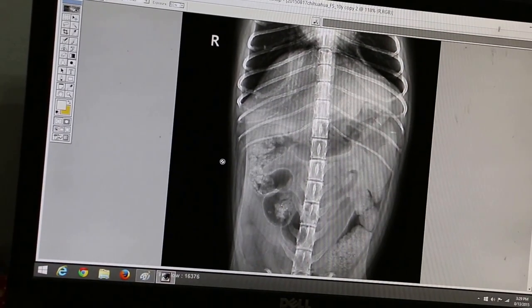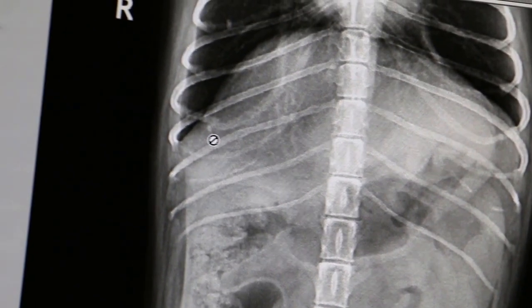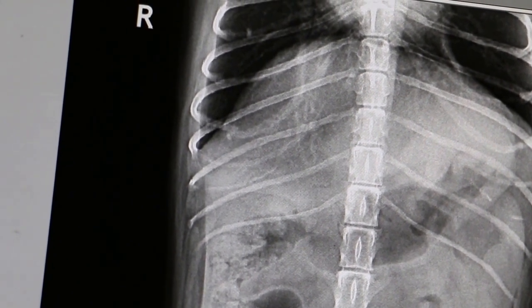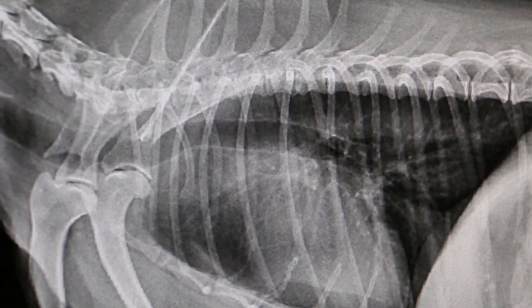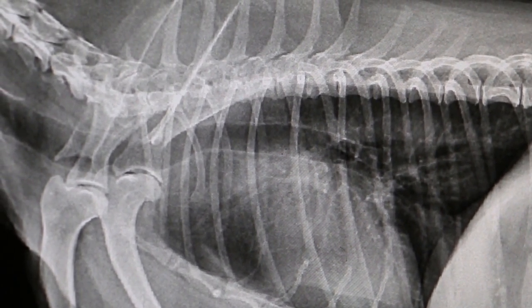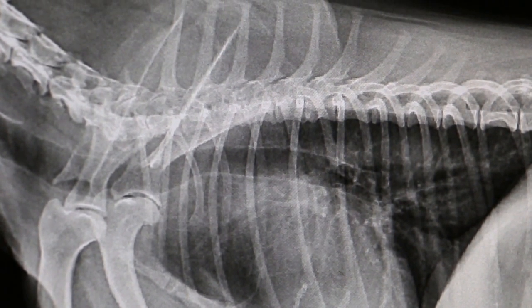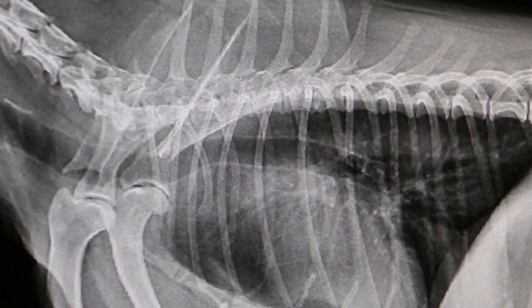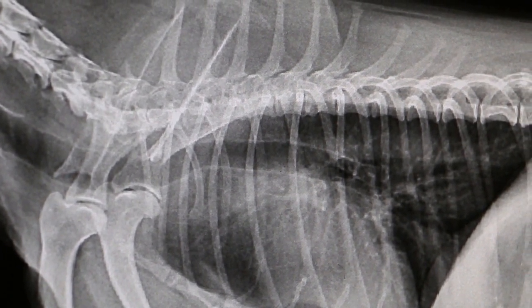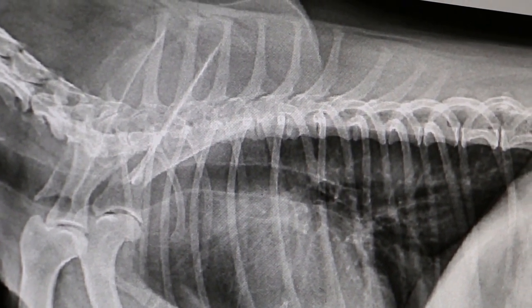Now we bring it down to the smaller view — even on the overall view you can still see it quite prominently. Then I'll show you the side view. Okay, side view: rib 13, 12 — rib 13 is the floating rib. Then 12, 11, 10, 9.